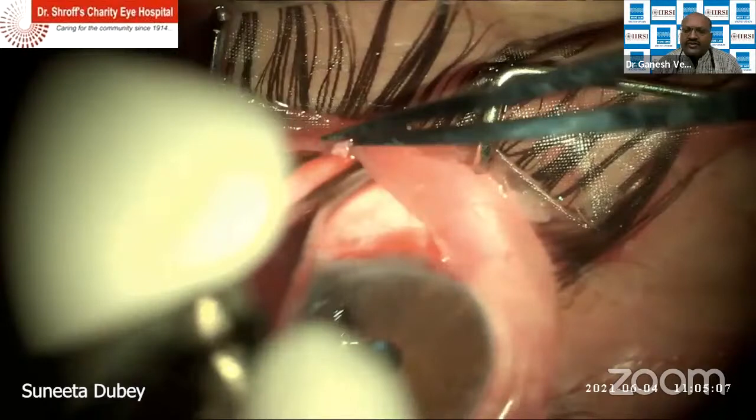And I use a triangular flap. So the first releasable suture to go is the apical one. Then I start removing the side sutures. I do it at about 5 days, depending on how far the patient is coming from, how easily he is able to access our services. So that's how we use Ologen in our center. We don't mix it with mitomycin C.